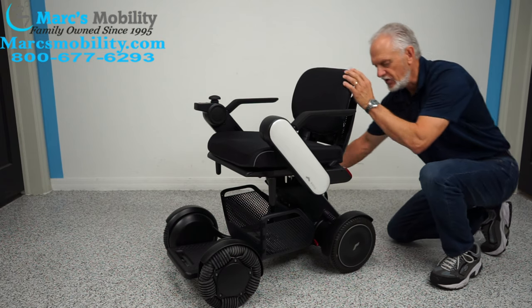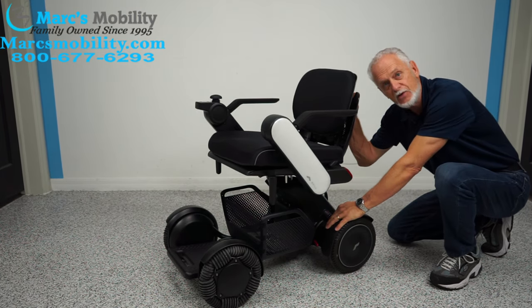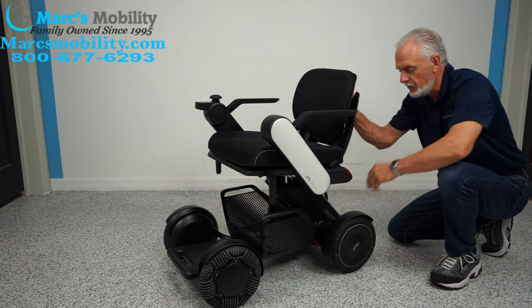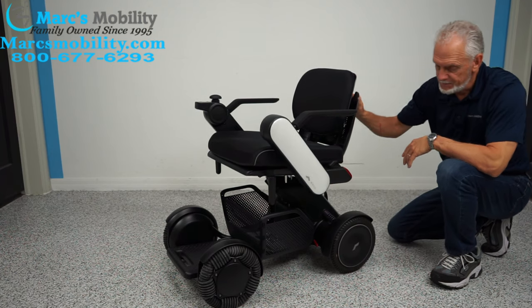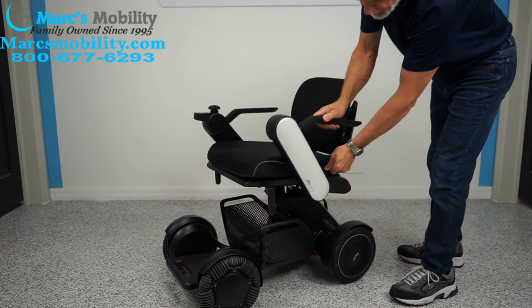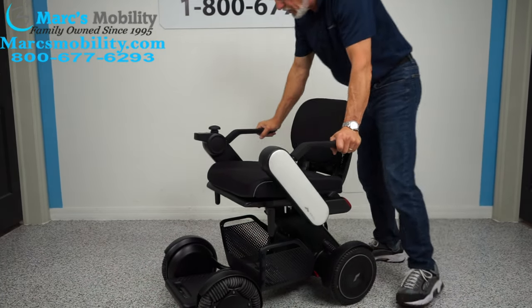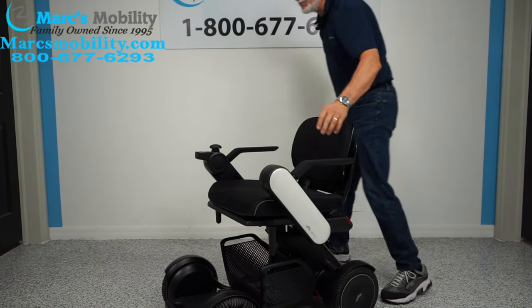If you ever take this chair apart and put it back in the car when it's not running, make sure you check your handles. If you push one of those handles down on one wheel, it'll blink on your joystick. Make sure the wheels are always locked when you put it back together. Also, these arms are really, really solid — this is a very well-constructed power chair.